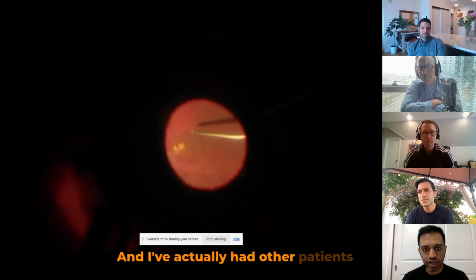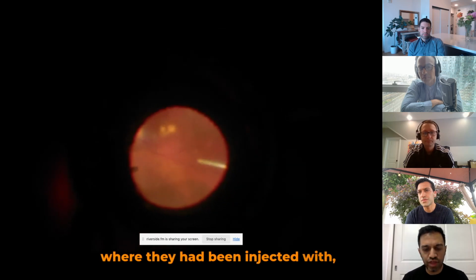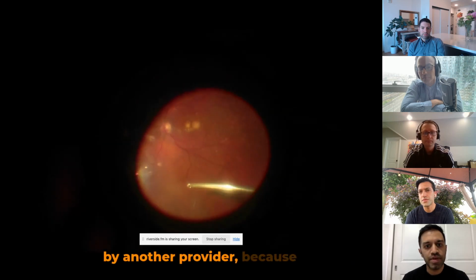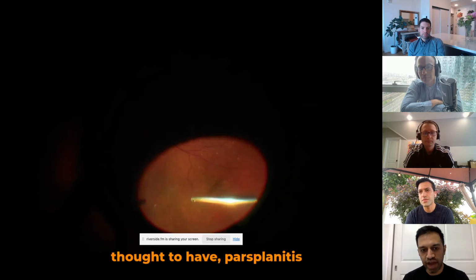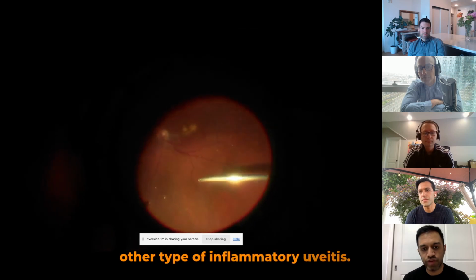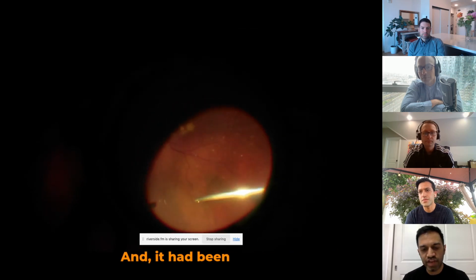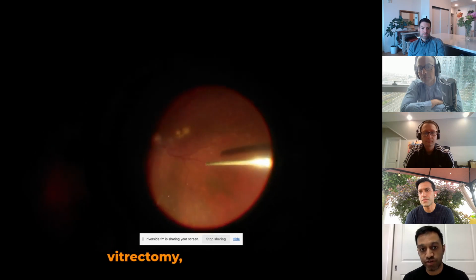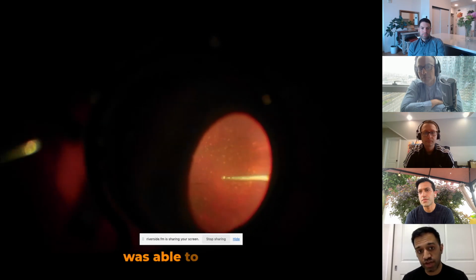And I've actually had other patients where they had been injected with Kenalog or Triesence by another provider, because they were thought to have pars planitis or some other type of inflammatory uveitis. And it had been sitting there for a while. And doing a diagnostic vitrectomy, even with that in the eye, I was able to get a positive sample.